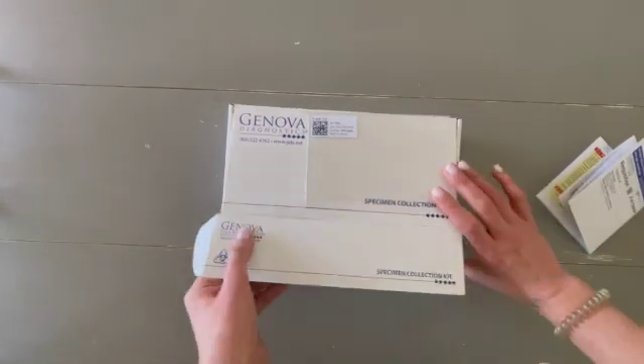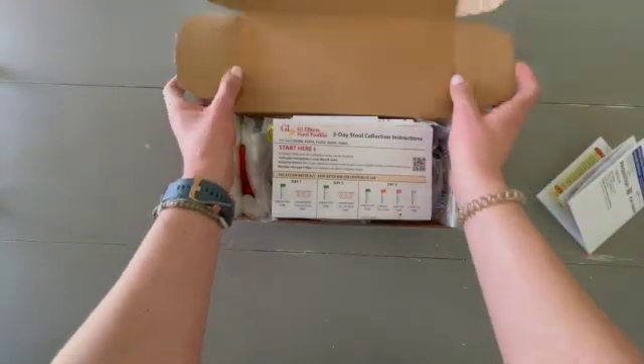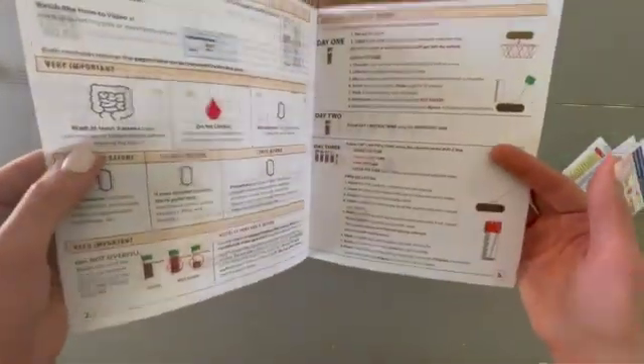When you open the kit, the first thing you'll find is the instructions. This will be kind of your guiding light. They are pretty clear, but I'll still walk you through what to expect and what you'll find inside.